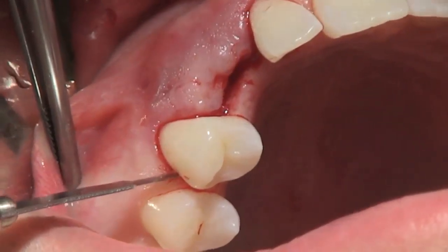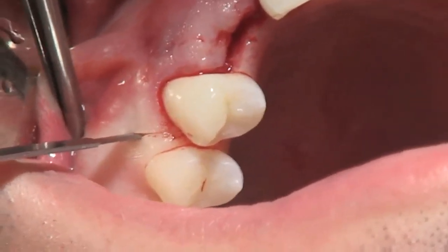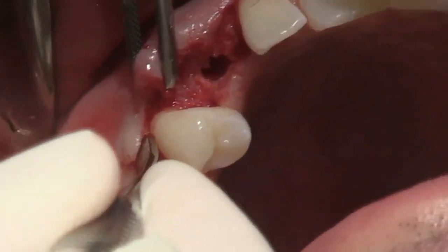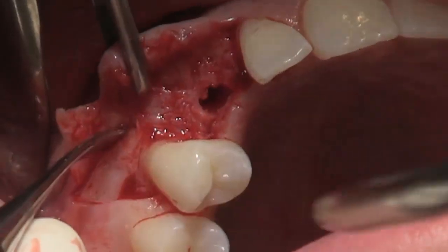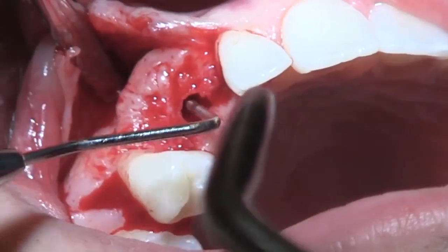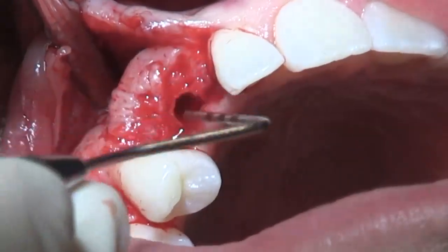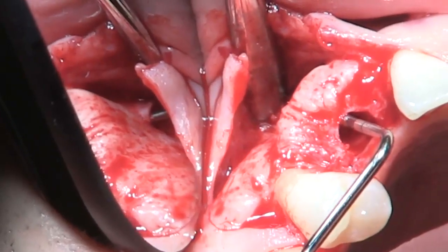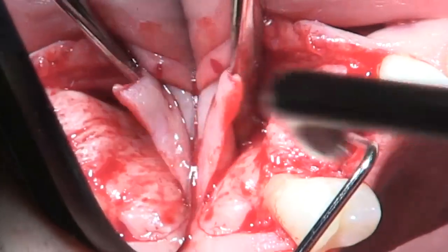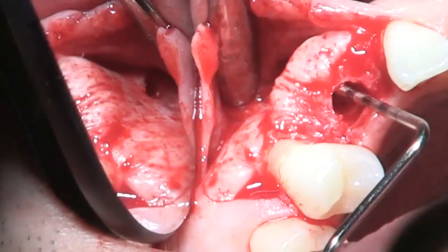To access the buccal perforation, a vertical incision is applied using the microblade on the distal buccal line angle of the first premolar. Full thickness flap elevation showcases the buccal bone, and using an implant probe, the perforation can be directly accessed and evaluated for size and complexity. In this implant site, the perforation is moderate and at the apex of the implant osteotomy.